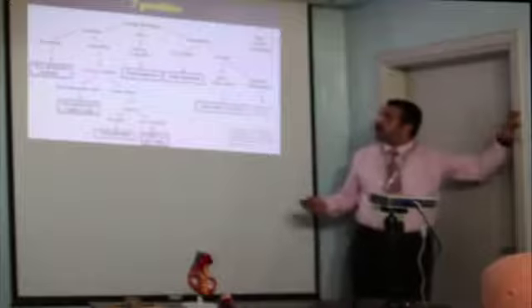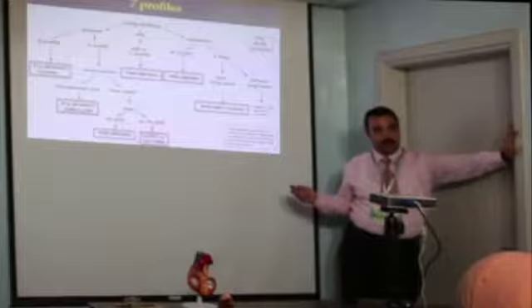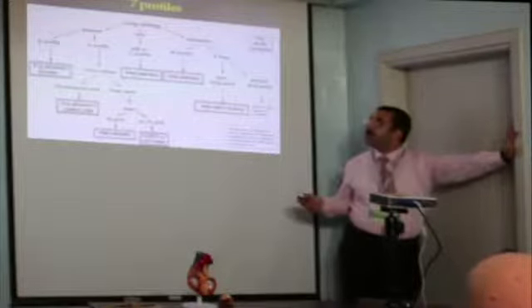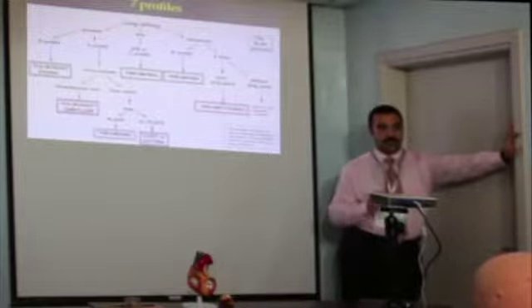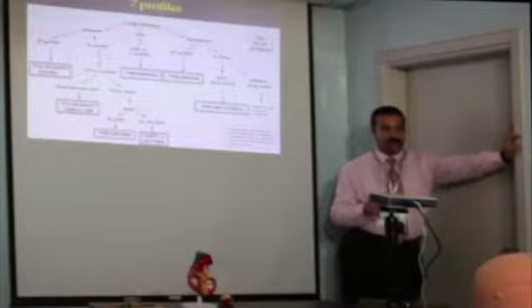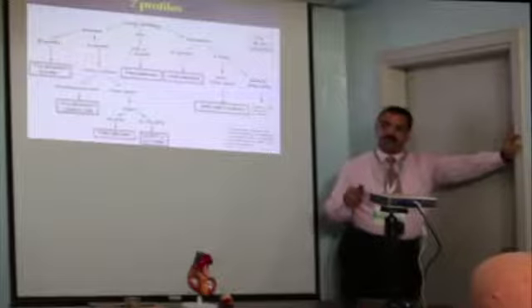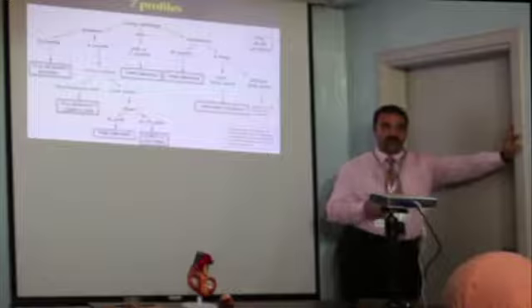Okay, if you diagnose pulmonary edema, we said we'll diagnose the underlying cause by echo. I advise you at this time to go to the mitral inflow and measure the E/A ratio. You will find something good. Correlate that with the pulmonary artery occlusion pressure, whether it is more than 18 or less than 18, as per the E/A ratio. And today, I promise, if we have the time, we'll do the tissue Doppler to do E/E prime.